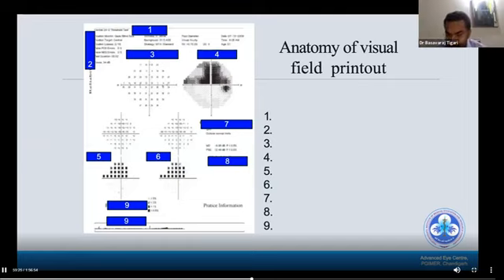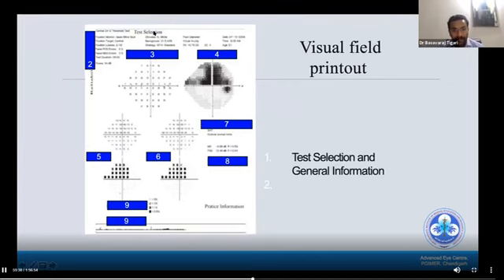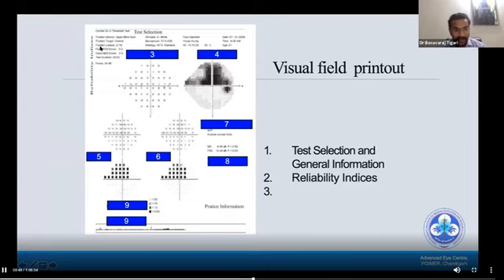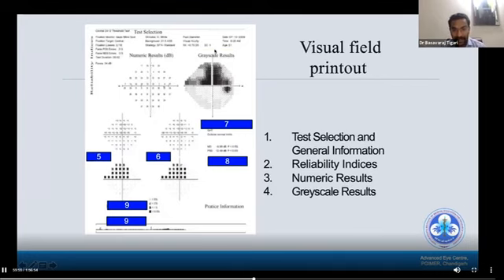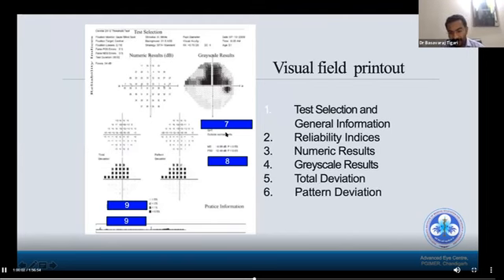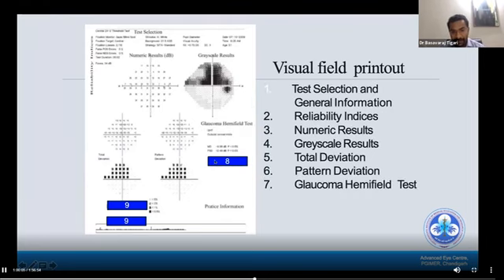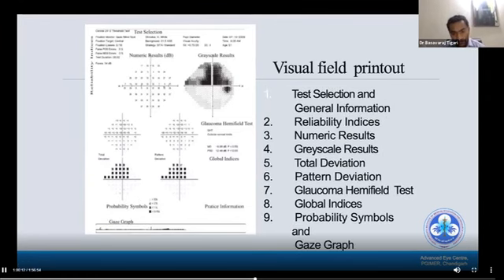The basic visual field printout has nine important parts — this is called the anatomy of the visual field printout, specifically the single field analysis printout. First is test selection and general information parameters. Second is reliability indices: fixation losses, false positive errors, and false negative errors. Third is numerical results. Fourth is grayscale. Fifth is total deviation. Sixth is pattern deviation. Seventh is the glaucoma hemifield test. Eighth is global indices. Ninth is probability symbols and the gaze graph.